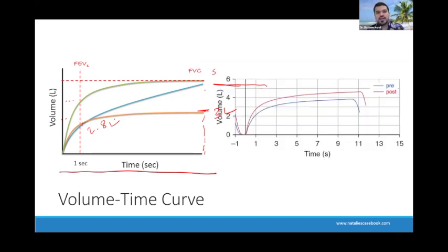Okay. This is the example from the actual report provided by the ATS. So if you look at this, what do you think is the diagnosis based on this volume time curve for our patient?